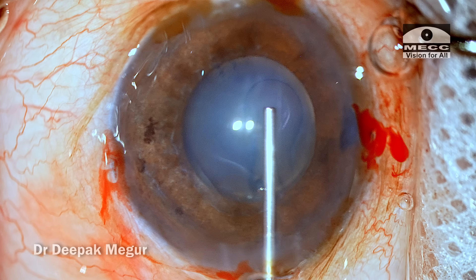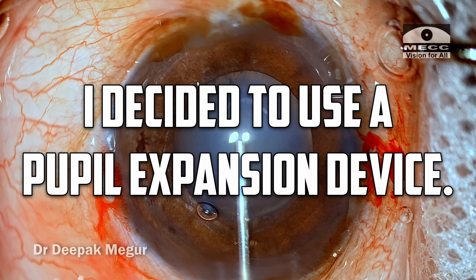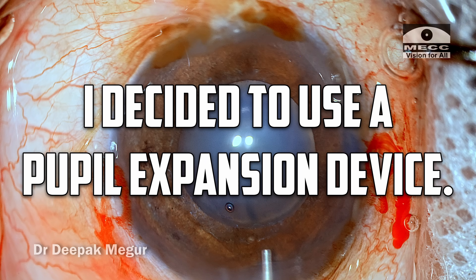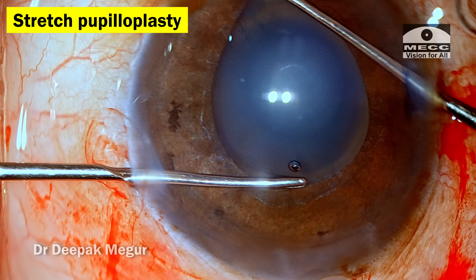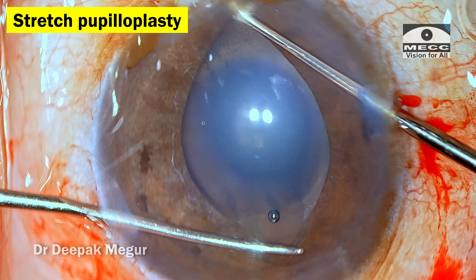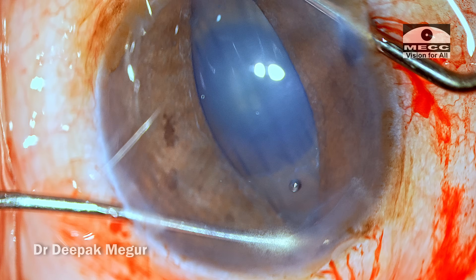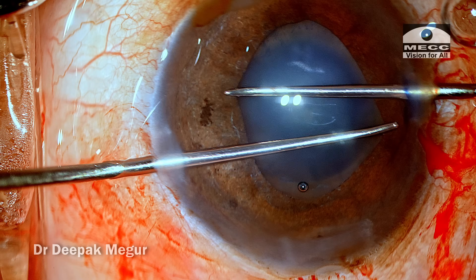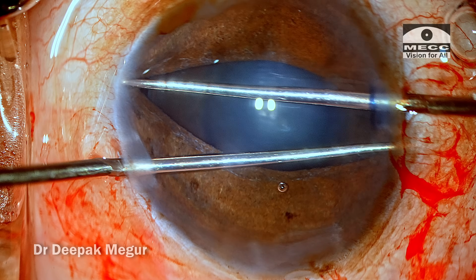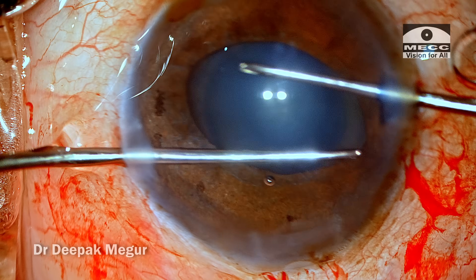Because I'm encountering significant zonulopathy, I want to have an unhindered view throughout the entire course of the surgery, and that's the reason why I've decided to use a pupil expansion device. In this eye, I'm going to use the Gupta pupil expansion device simply because it's going to give me a larger pupillary expansion, which is going to help me maneuver safely intraoperatively in this complex case.